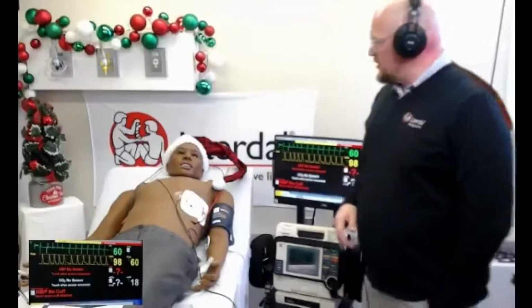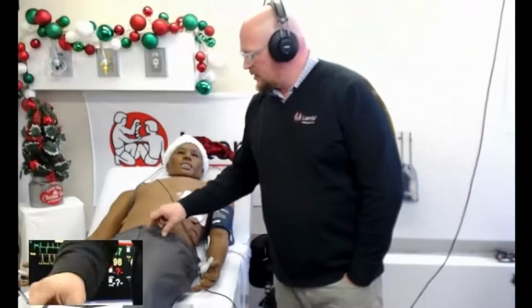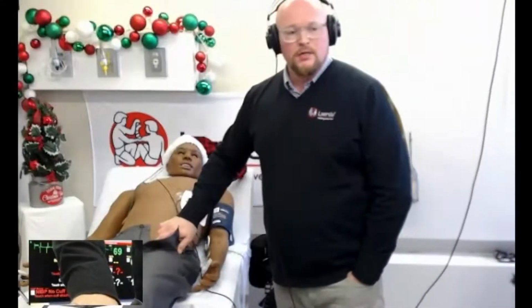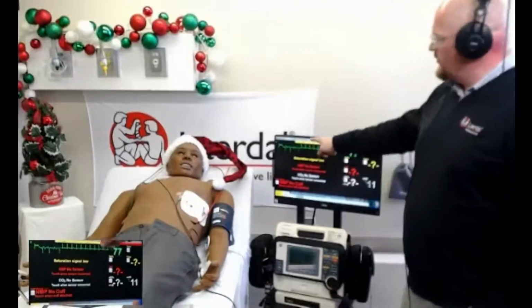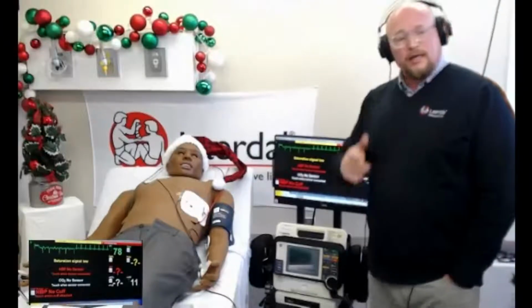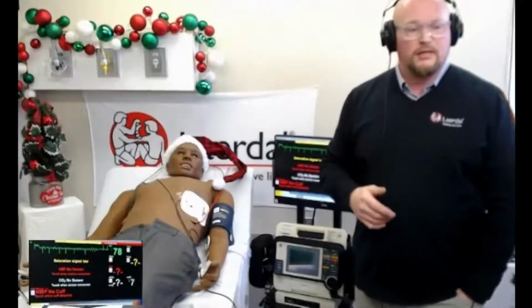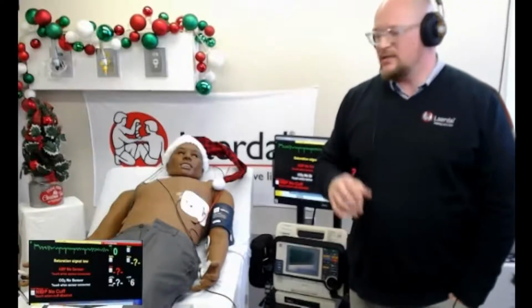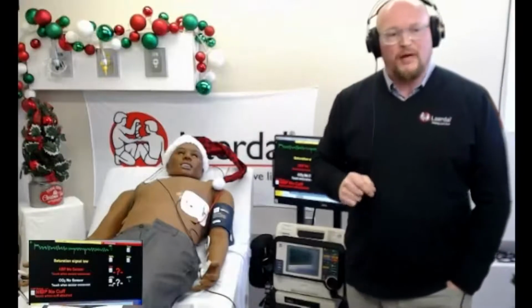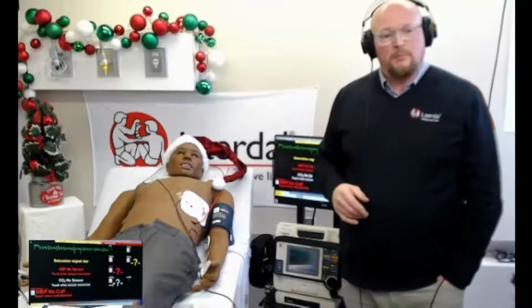The last thing I was going to show you is I was going to do a full defibrillation so that we can see the 200 joules. I have it programmed that if I touch the left femoral pulse, he goes into a VFib arrest. Again, this scenario is going to be free in the resource library of Laerdal.com. If you go to the resource library and go to the HSL simulation webcast, this scenario is going to be dropped right there for you. If you want to play with the scenario and see how I did it, you're more than welcome to.